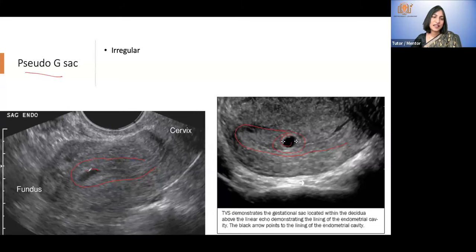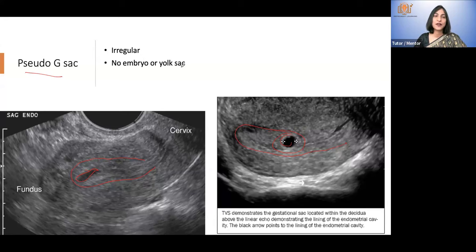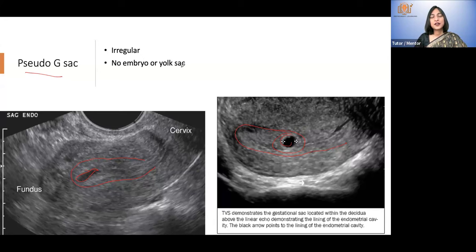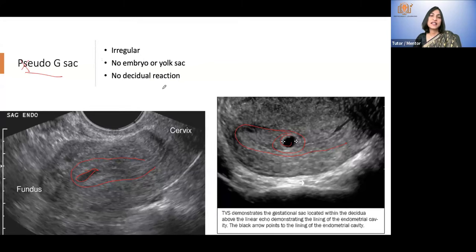A pseudo-gestational sac can be irregular — here it is an oblong cavity, not like a gestational sac. There is no embryo. Very importantly, if you see an embryo or yolk sac inside the sac it is not a pseudo-gestational sac — it is ruled out and it is a true gestational sac. Pseudo-gestational sac may or may not be irregular, should not have an embryo or yolk sac, and should not have a localized decidual reaction. That is when you call it a pseudo-gestational sac.